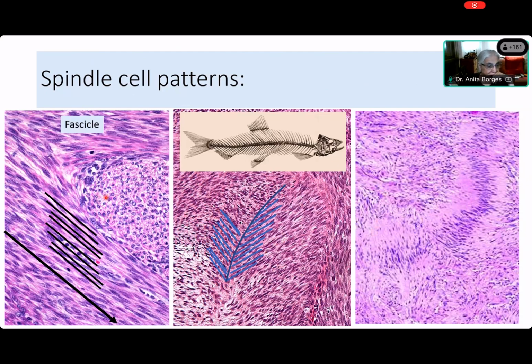Now, who's going to take the next? Come on, Aditi. What's this? That is seen. So this is, of course, a herringbone pattern. The next one, Aditi, which is on the right. Are you there, Aditi? Or maybe Aditi has disappeared. I don't know. Priyamada, are you there?